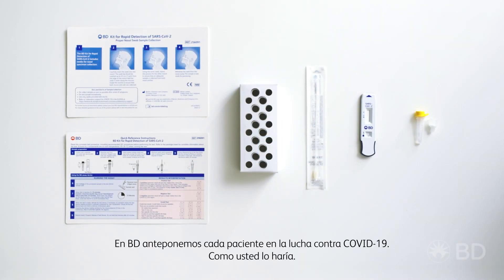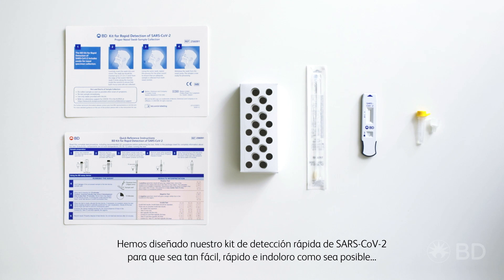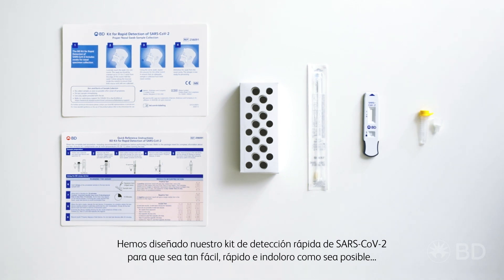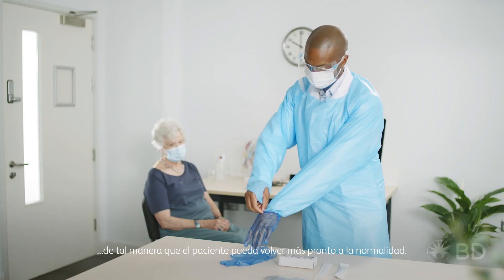Here at BD, we put every patient first in the fight against COVID-19, just like you do. We designed our kit for rapid detection of SARS-CoV-2 to be as easy, fast and painless as possible, so that your patient can get back to normal sooner.